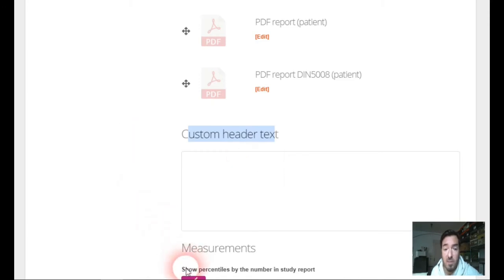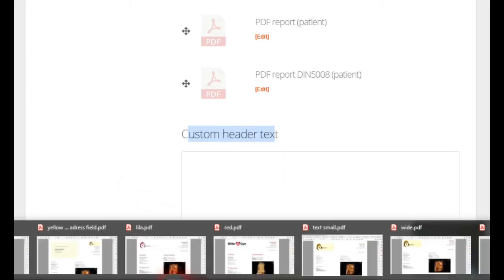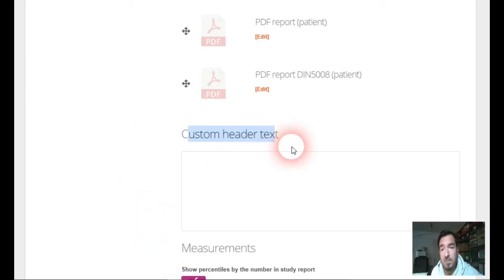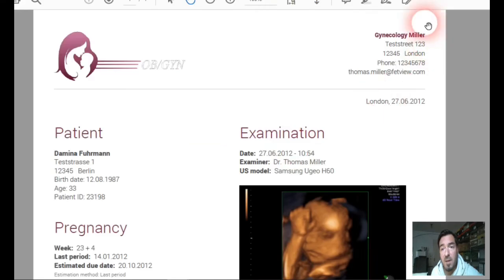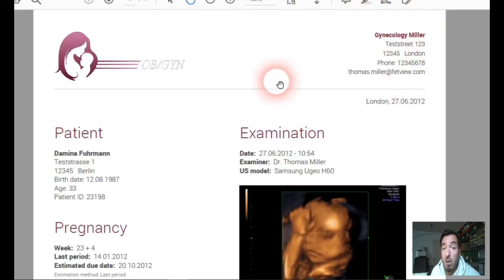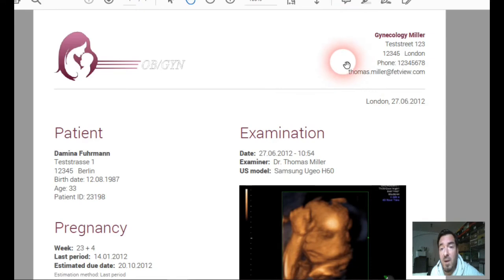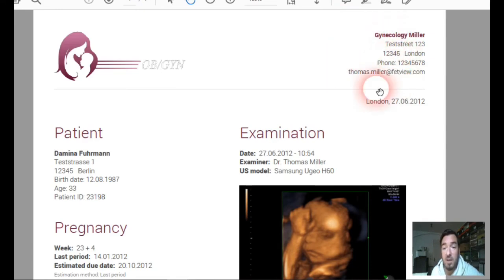Here you can write the information about the practice if you want to have in your header of the report some other information. Header of the report is this, of course. Here is the header of the report. The logo is the same, of course, but you can change here completely the whole text according to your needs.